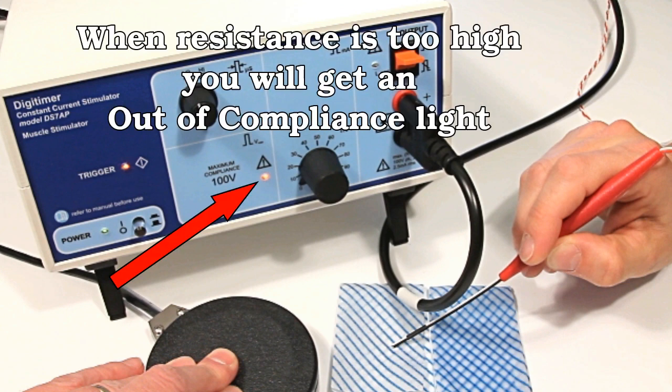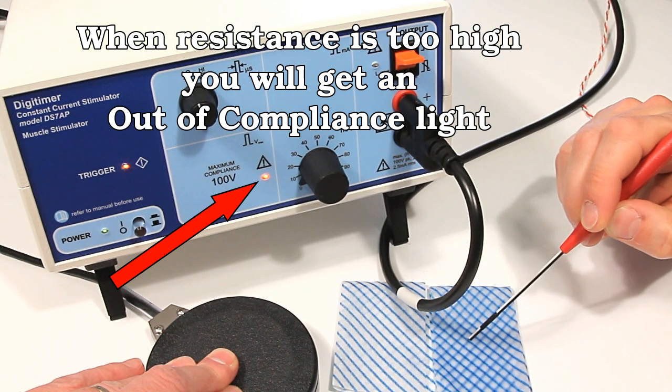With the current set to a low level and the probe tips held in the air or placed onto a dry paper towel, the voltage available within the stimulator is not adequate to pass the set current between the probe tips due to a high electrical resistance. The out of compliance warning LED illuminating signifies this.